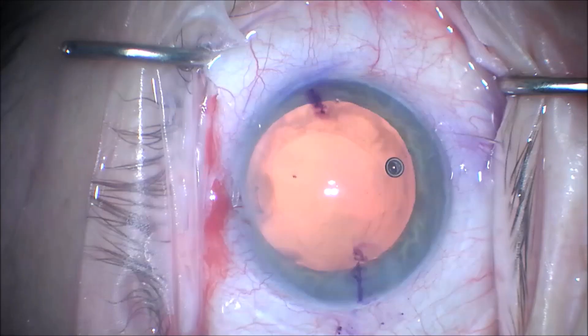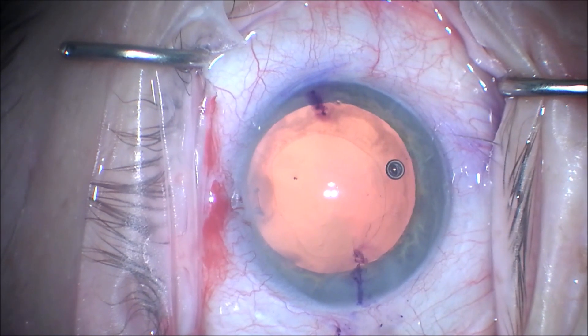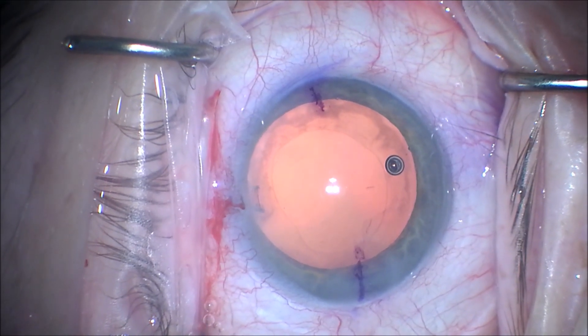We mark our cornea using a toric marker, and it is at approximately 170 degrees axis, and you can see our capsular bag is clean.